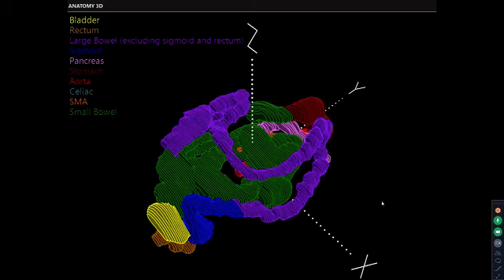Early on in residency, I had some amazing mentors, and our residency was structured such that I spent a fair amount of time in dosimetry, and you really start to appreciate, when you're looking at a DVH, everything that goes into that DVH. One of my mentors' sticking point was that for every pelvic and abdomen plan, it was necessary for the resident to really pay attention and contour the different portions of the bowel. At the time it seemed pretty laborious, but when you look at a DVH and think about all that goes into it, I'm glad that I had that experience, and it really carries over into the work that I do every day in assessing the quality of a plan.